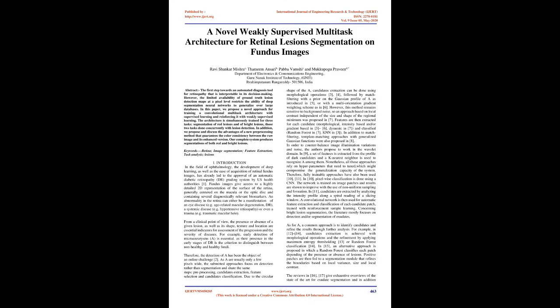A novel weakly supervised multitask architecture for retinal lesions segmentation on fundus images. Problem domain. Abstract: the first step towards an automated diagnosis tool for retinopathy that is interpretable in its decision-making.